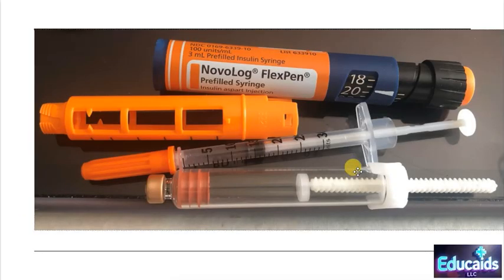We're going to go back over to our PowerPoint, and I'm going to show you what the inside of an insulin pen looks like. So this is an insulin pen that has been taken apart. Here is the spring-loaded mechanism. And so when we depress the button and then we have to count our 6 bananas, this way it has a chance for this to completely engage and then get all of that insulin pushed through the needle into our patient. So make sure that you're holding it on the patient's skin for a little bit.